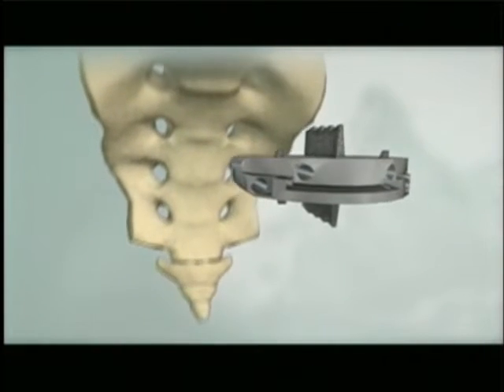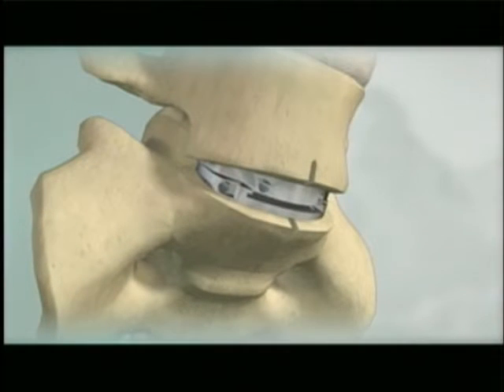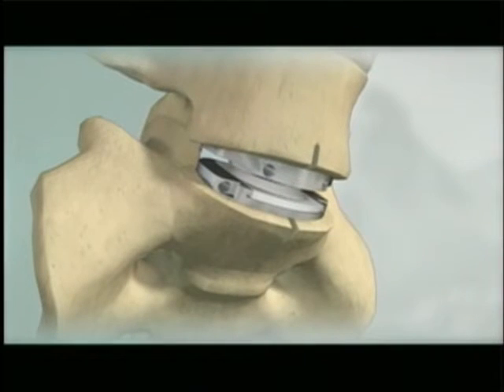The ProDisc L end plates are inserted in a collapsed position and then distracted for the polyethylene inlay insertion. This modular technique facilitates end plate insertion and provides controlled distraction for polyethylene inlay assembly.